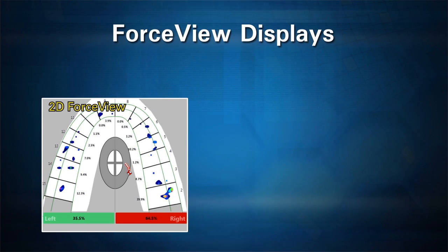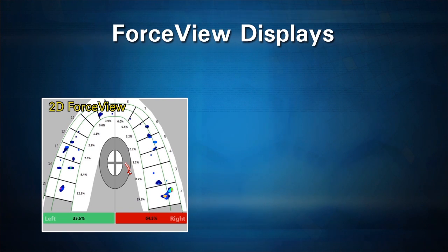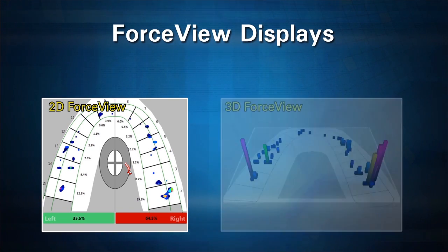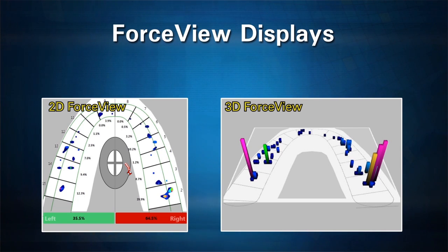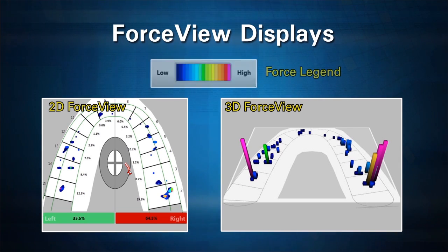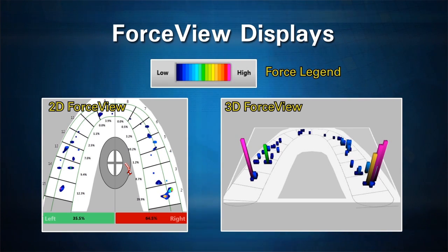T-Scan displays the digital force data in different ways. As you can see in this example, there is a 2D view that most closely resembles articulating paper marks. There is also a 3D view, which is a great tool for patient education because you can see the height of the column correlating with the intensity of the force. The software provides a force legend that shows different force levels graphically displayed by color coding, from lowest forces in blue through middle forces green and yellow, up to the highest forces pink and red.